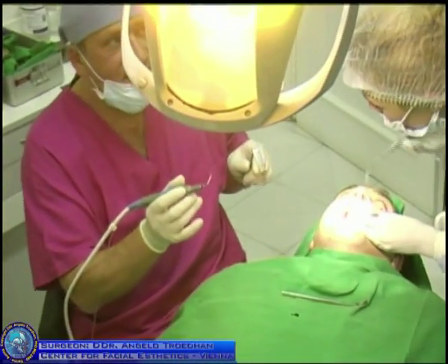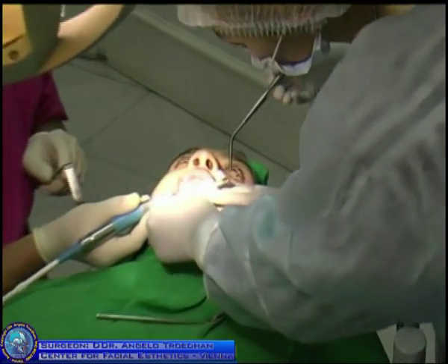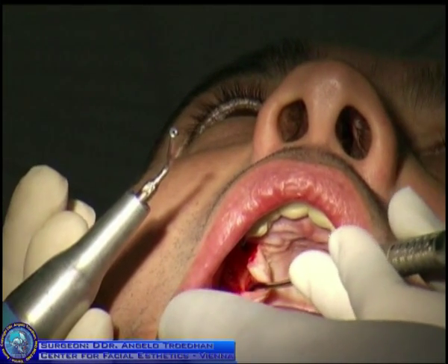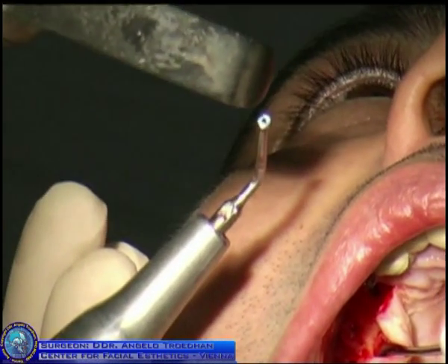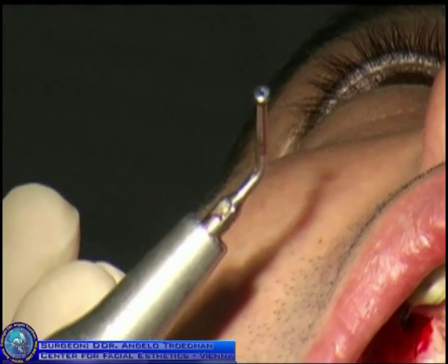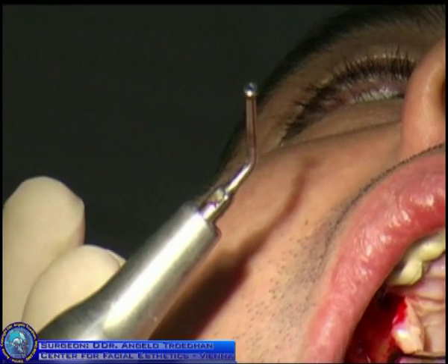So, and now this is the main thing of the whole intralift procedure. I have this little trumpet with the hole at the end. And the water that is flowing through this trumpet is activated by ultrasonic waves. And it gives an oscillating water column.